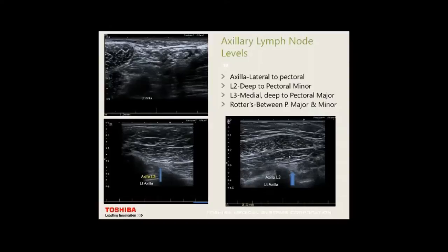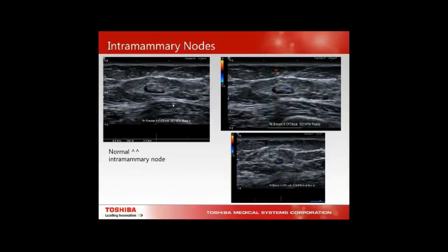Level 2 nodes are deep to pec major and pec minor; you can identify normal nodes in a fatty breast because they tend to have a fatty hilum. Level 3 is more medially near the sternum, scanned with the patient's arm up; they're where the pec minor has dissipated. Rotter's nodes are those nodes in between. Don't forget intramammary nodes — they appear among the breast tissue with a nice cortical appearance.